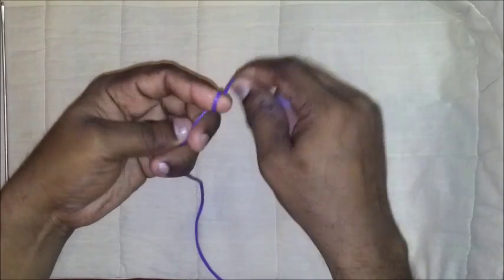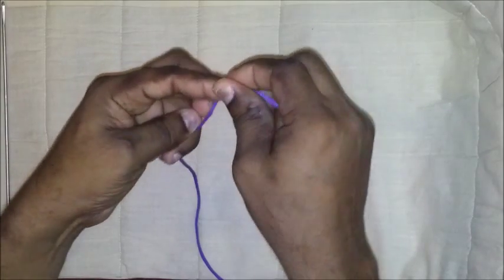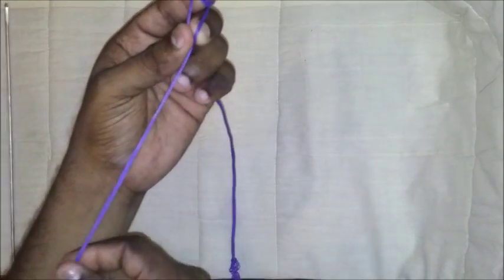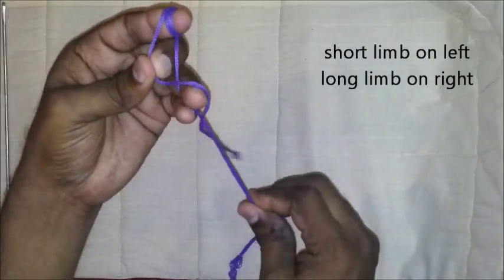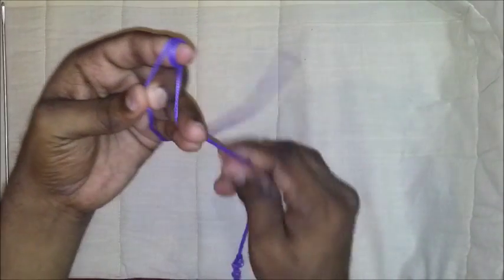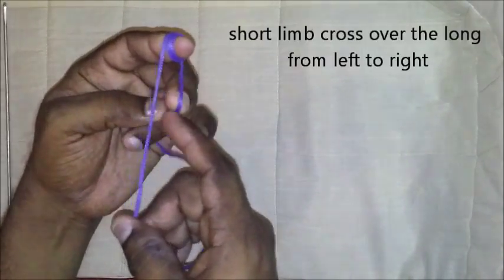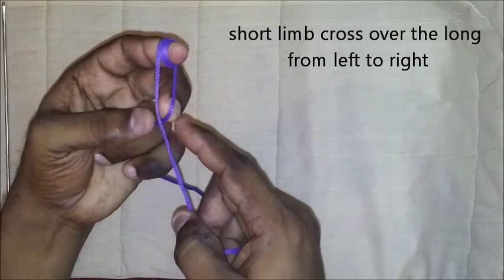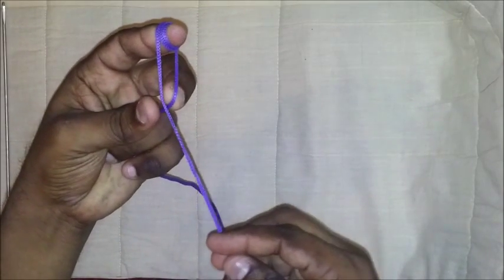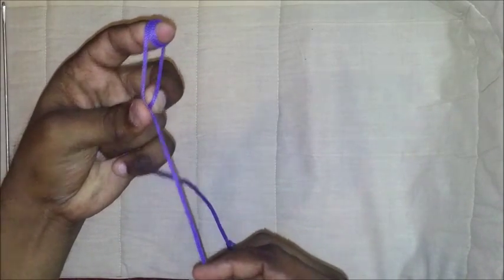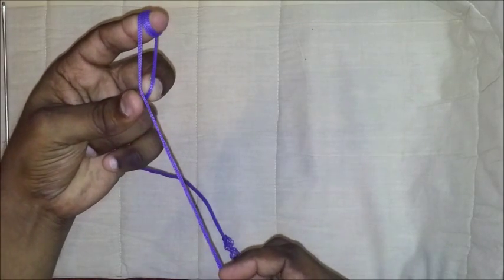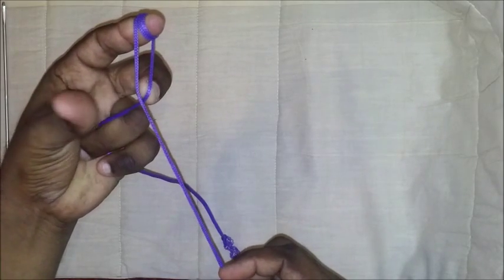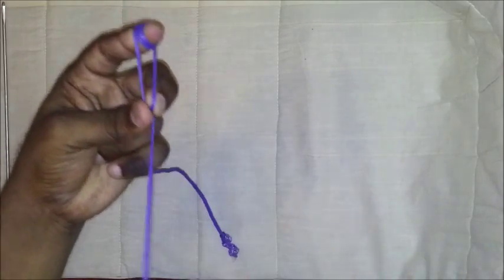I will wrap the thread over my left index, leaving the short limb on the left and the long limb on the right. The short should cross over the long, and the intersection is kept between the thumb and the middle finger.